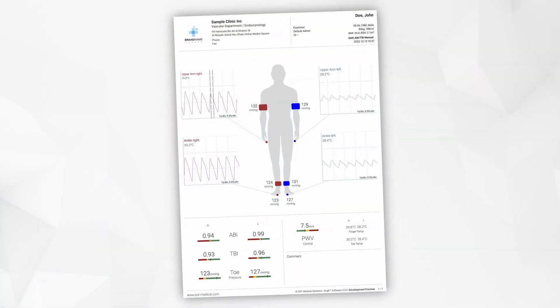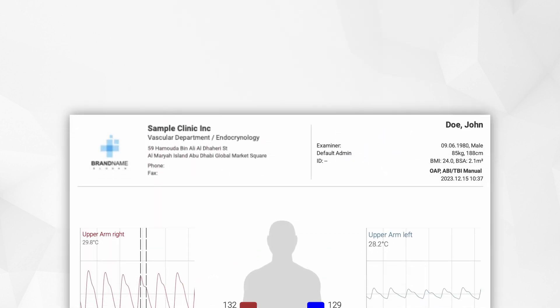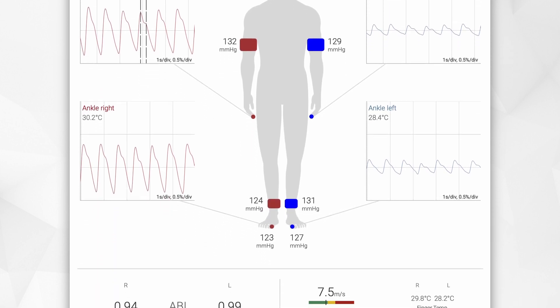The results of the measurement are displayed in a single page report. It is easy to read and can be configured with your custom logo.